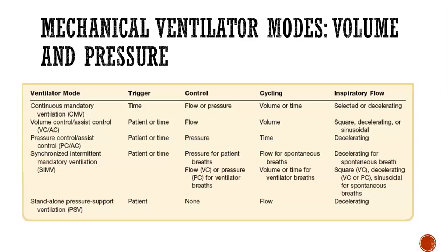The ventilator with PC-AC is still taking complete control over the patient's breathing. But the key difference between the VC and the PC is how that breath is delivered. Volume control is set to a certain tidal volume to be delivered with each breath as the peak inspiratory pressure varies. Then we have pressure control, which has a set peak inspiratory pressure with each breath and volume that will vary. So volumes will vary and be lower for, like, overweight pneumonia patients versus a healthy young non-smoker.